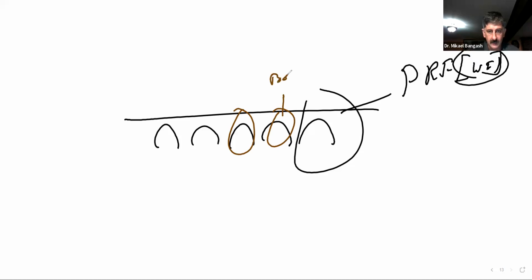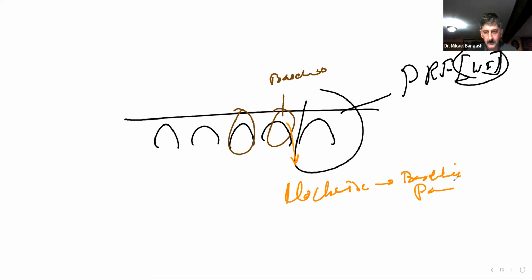But that's going to say baseline. So, my girls, if you turn that anti-clockwise, oh sorry, clockwise, that is just going to move the baseline down. Whereas if you turn it the other way, it's just going to move the baseline up.